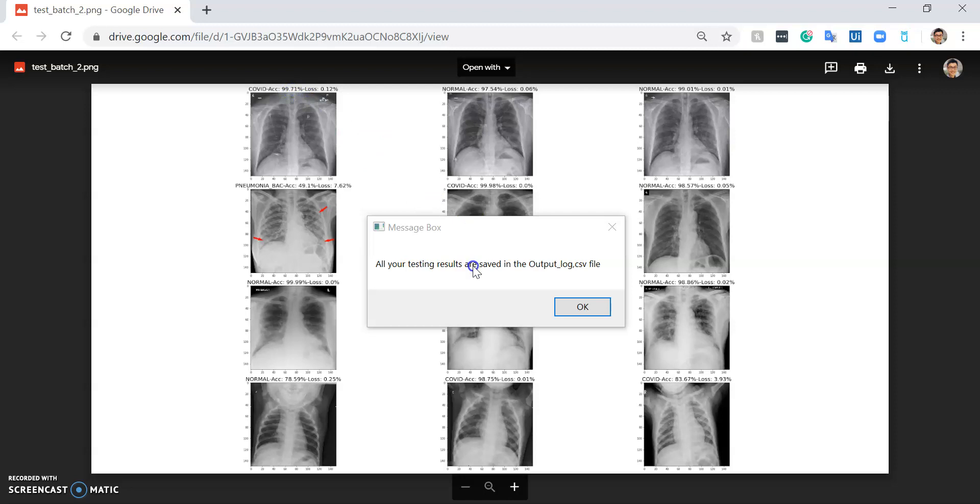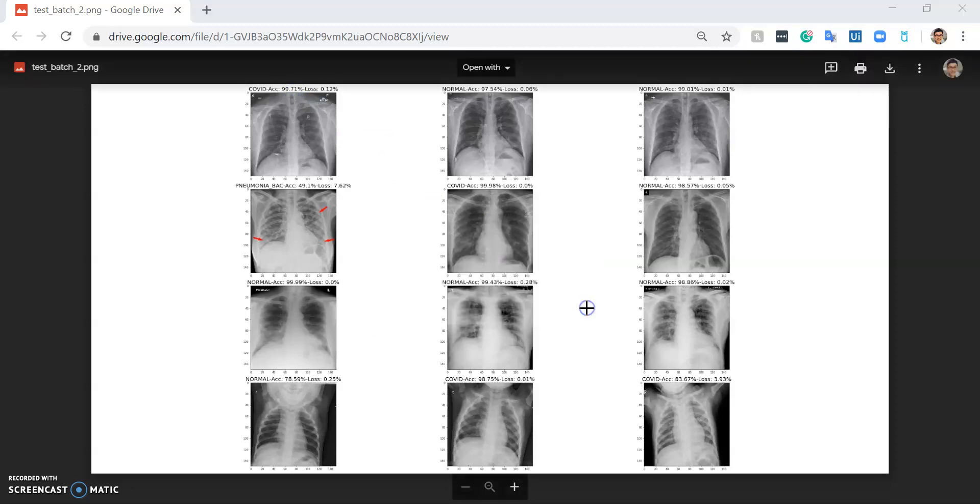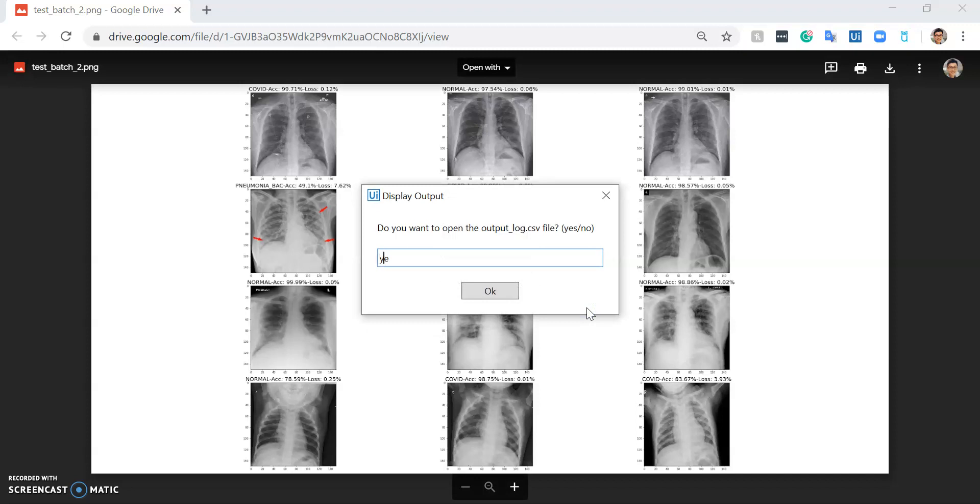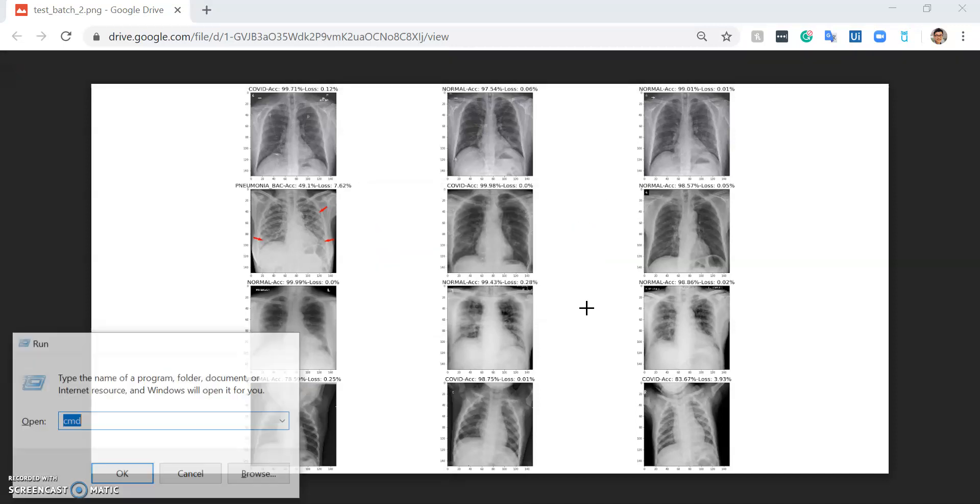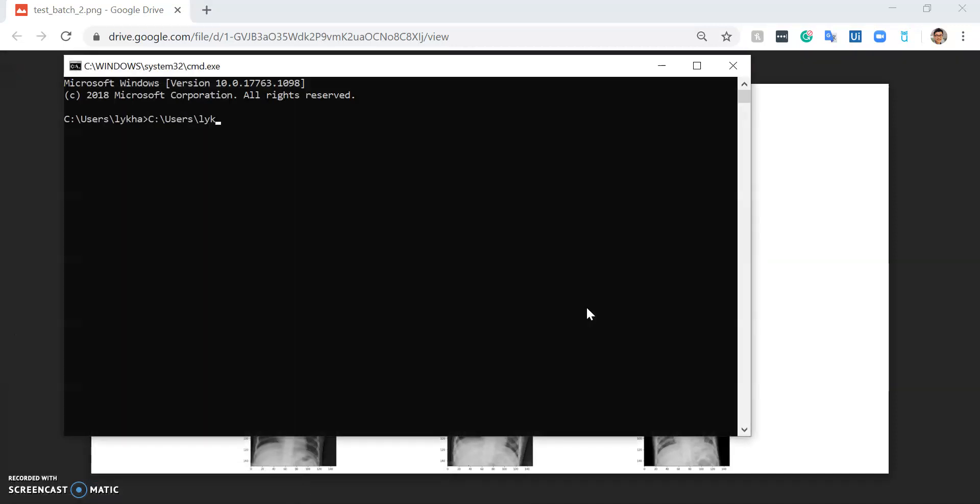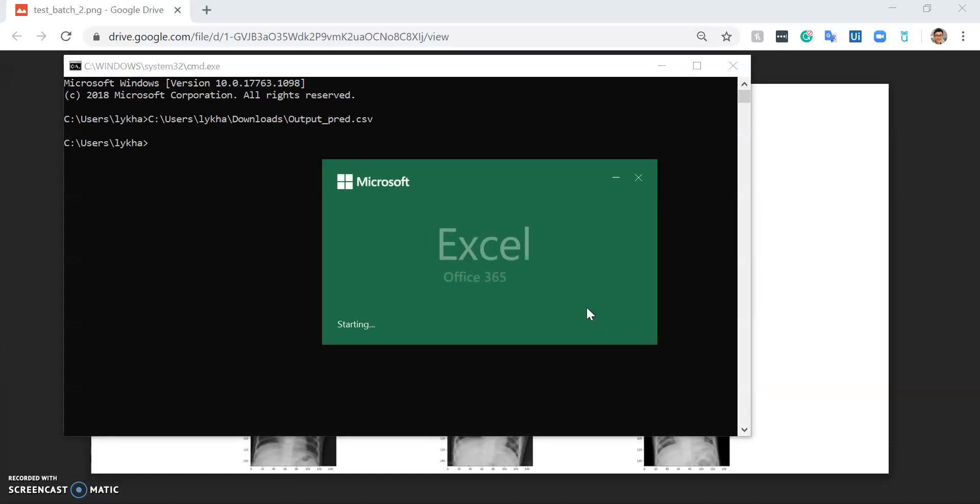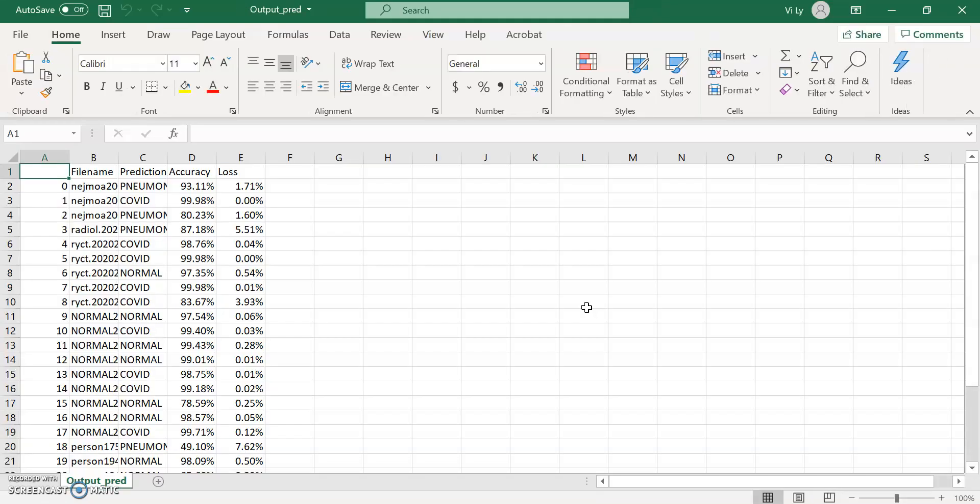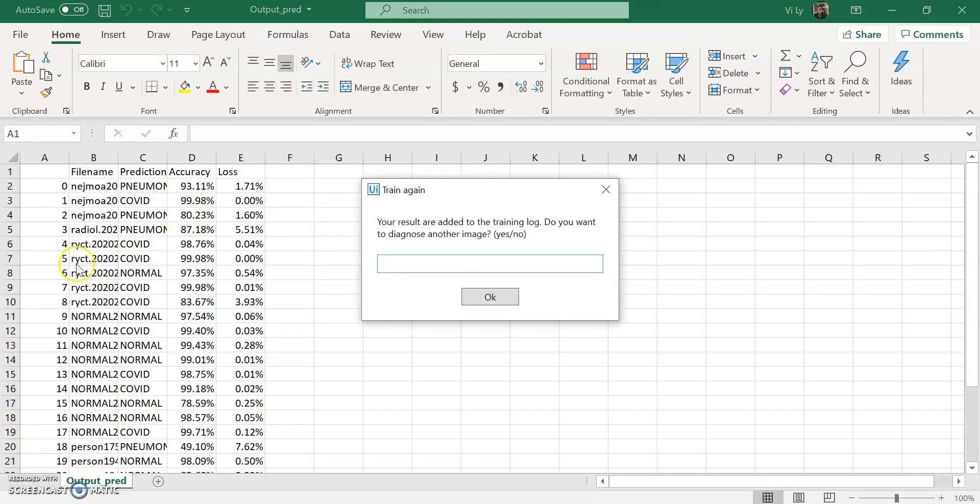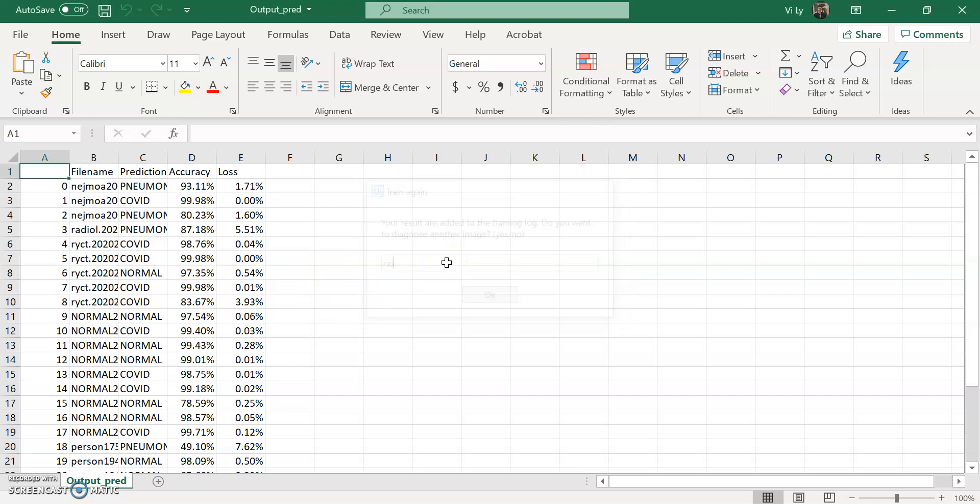It asks me if I want to save all the output into a log - I say yes. Then I open the log to see. This log helps keep track of all the test results that were done before in the form of a CSV file like this. It asks if I want to test again - I say no. If I say yes, it just goes back to the first step, which is opening Google Colab.